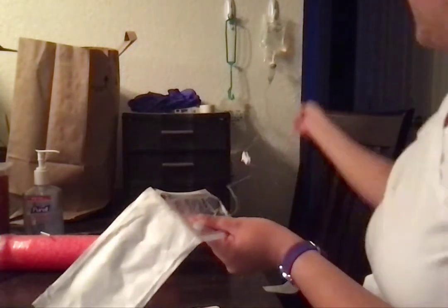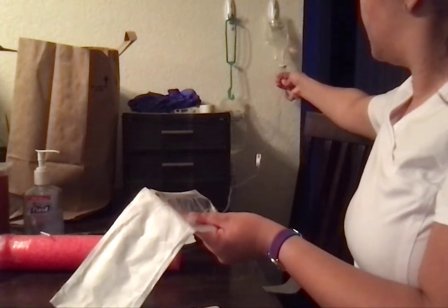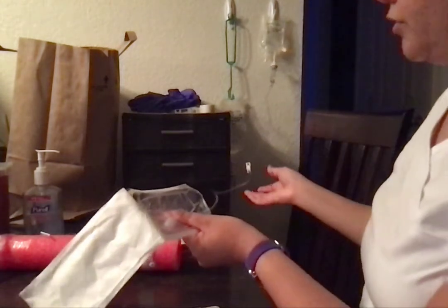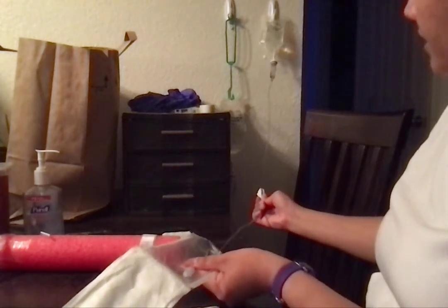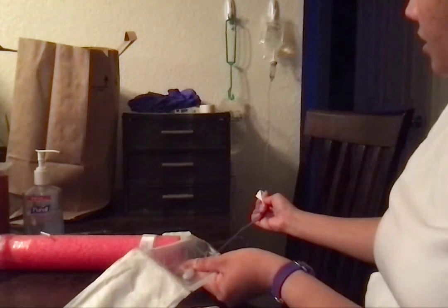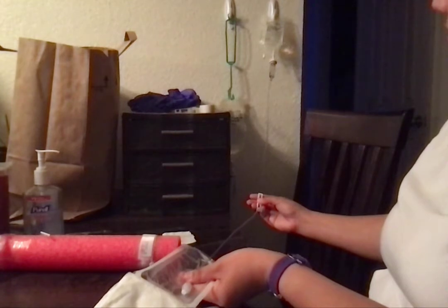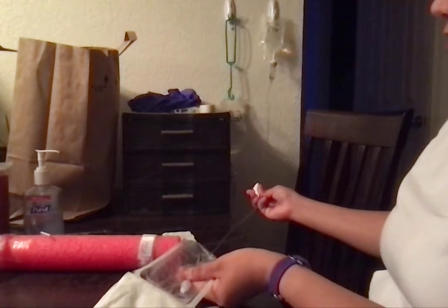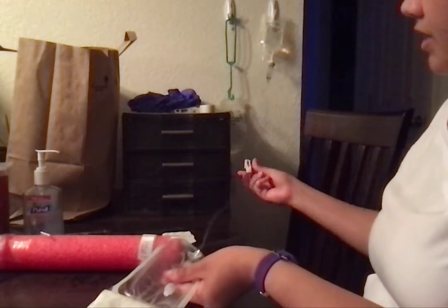Okay, I'm going to carefully fill the chamber, about between a third and halfway. I'm going to prime the line, making sure that we don't lose any medication. Just making sure there's no air bubbles in the line. Perfect. No bubbles, and we didn't lose any medication either.